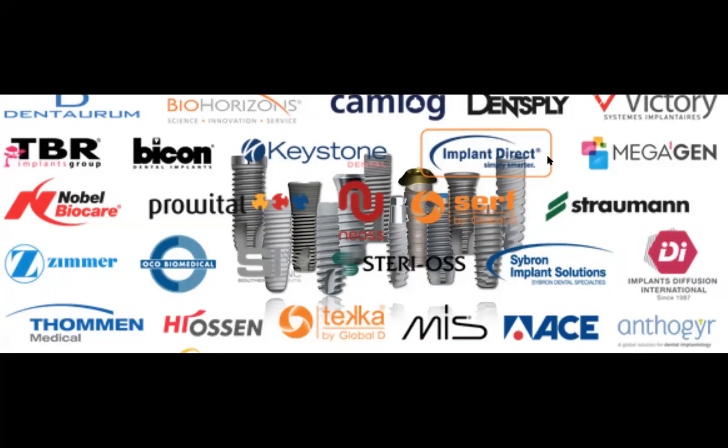If you're doing it posterior, you want to have a wide neck implant, you want to have something with a wide platform. So of course there are certain advantages to the design based on a particular treatment that you are rendering for the patient. But at the end of the day, the ultimate goal of any implant system should be ease of prosthetic use.